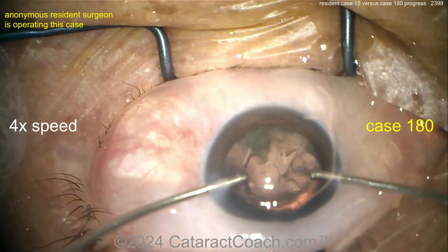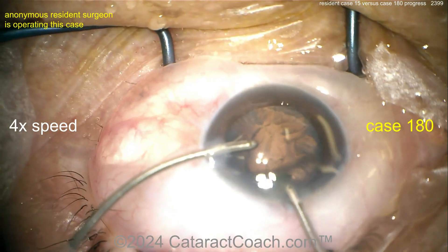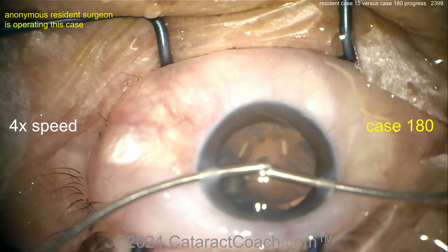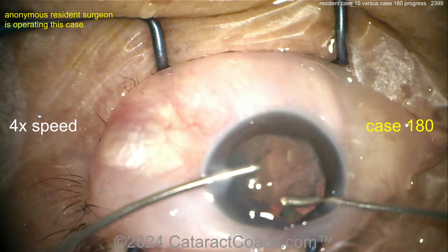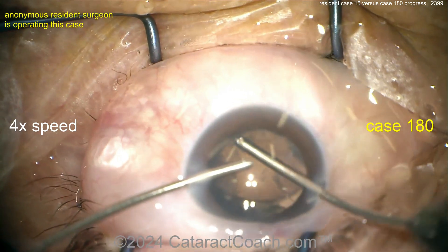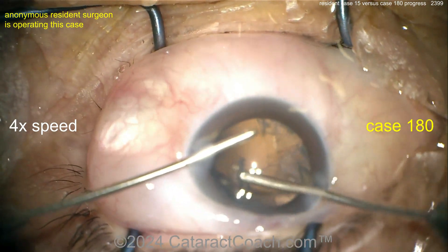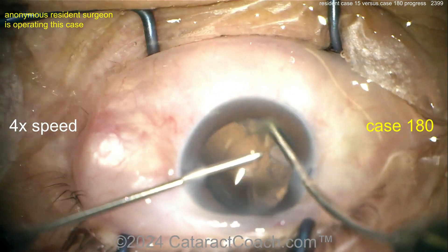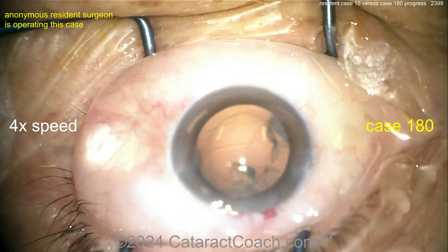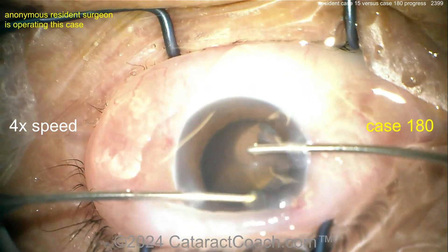In a case like this, you've got to position the patient — lift the chin up. There's still a nuclear piece you can flush out of the eye. Cleaning it up — there's certainly some improvement here. The incision was better. The rhexis is still kind of not ideal for case 180. The divide and conquer or stop and chop technique was very good, cortex removal was good. But now — look — we've got chemosis, a lot of chemosis. Maybe one of those incisions was hitting too much conjunctiva. There's a delicate balance to get that incision right.